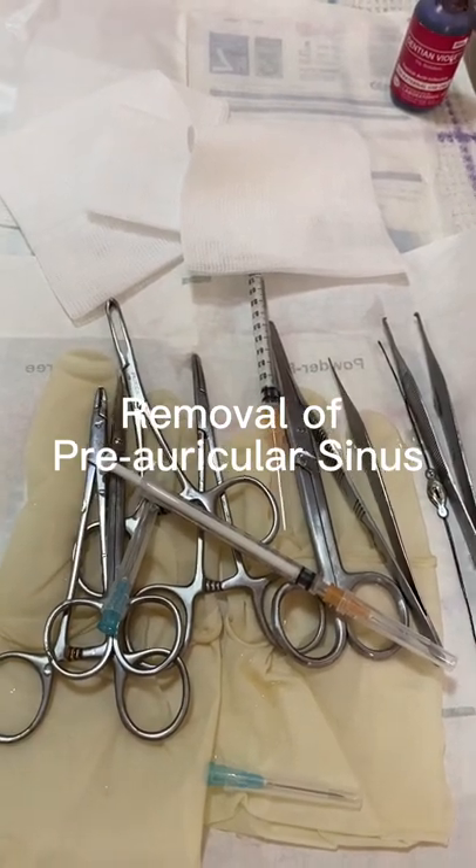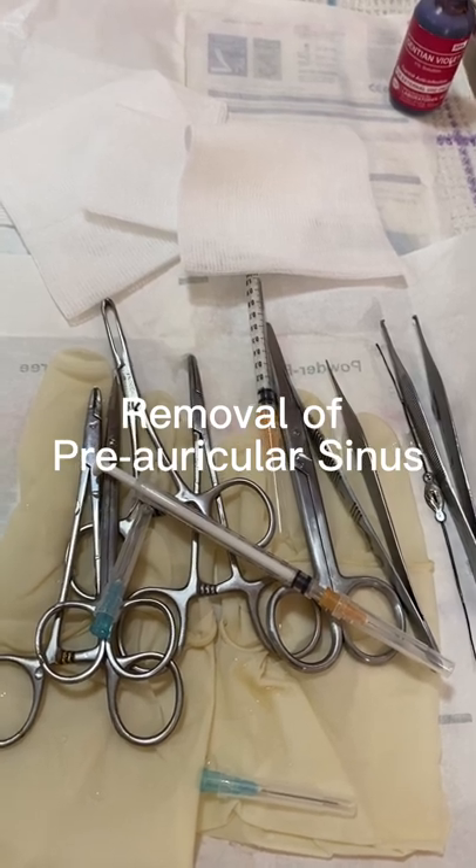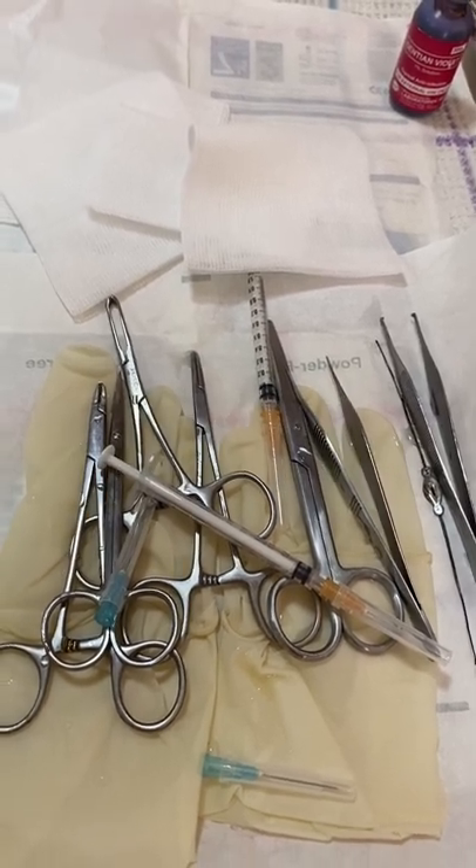Today, I'm going to do a minor surgical procedure to remove a preauricular fistula.